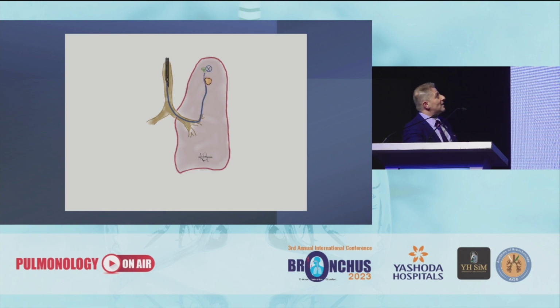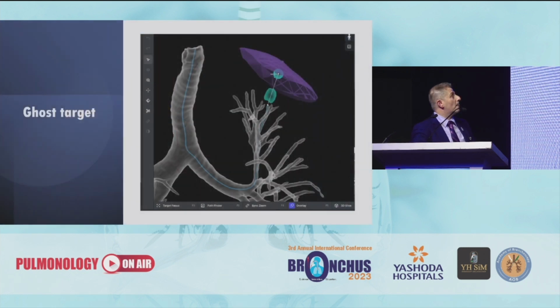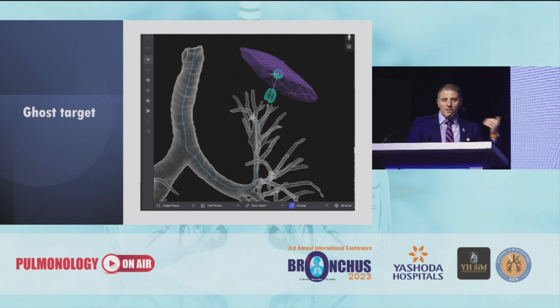So for example, in this case, we might put the fiducial right here, or right here, but not on the lesion, because you have that depth in the tissue that will not give you the chance to get a good signal when you put the firefly. This is how we planned this case. So we know the target here, but we created another target. And you know the robot always gives us the anatomy borders by a purple line, which is the pleura. In those cases, we want to be closer to the pleura to put that fiducial.